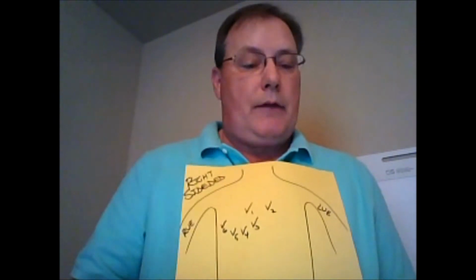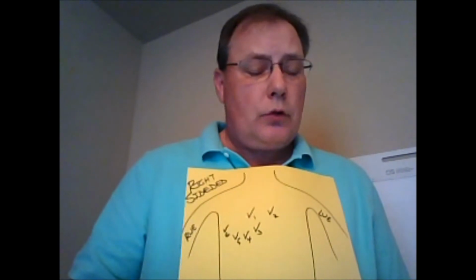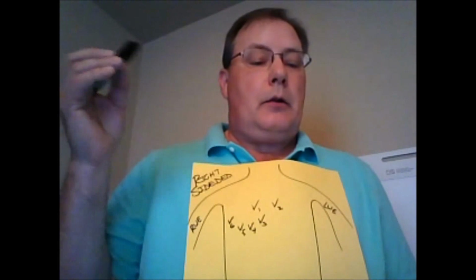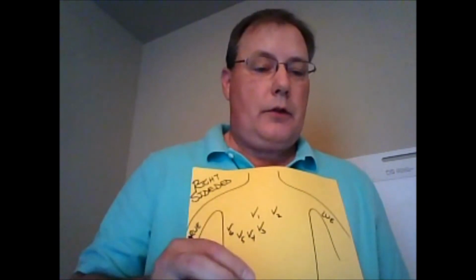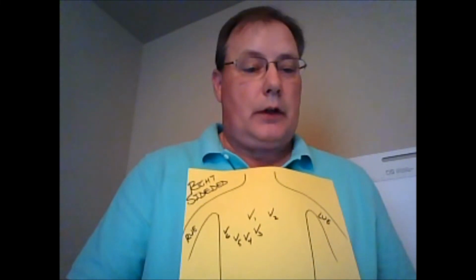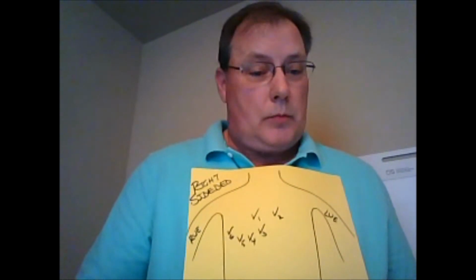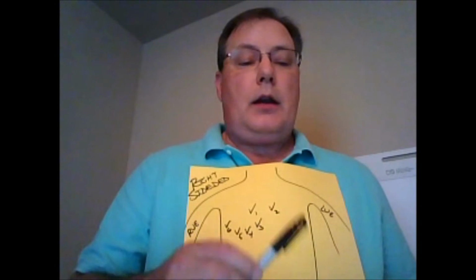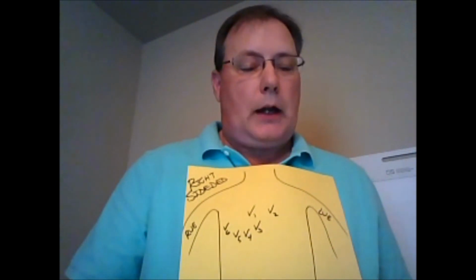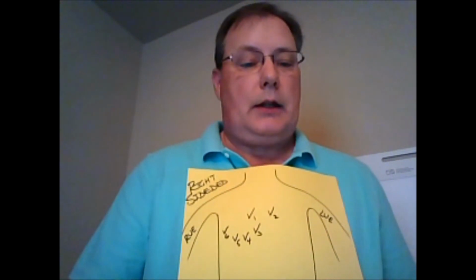The other is when you have that patient that comes in with chest pain, that the EKG looks okay, you give them nitroglycerin as part of your cardiac workup to help alleviate their chest pain, and their blood pressure tanks. That is another time. I learned this by having that very patient that was having an isolated right ventricular infarct, and my ER physician is the one that said, oh, you should do a right-sided EKG. Never done one before. He walked me through how to do that. But I remembered that ever since, and I've passed this along to a lot of my coworkers. And this is how myself and the educator developed an algorithm for doing right-sided EKGs.